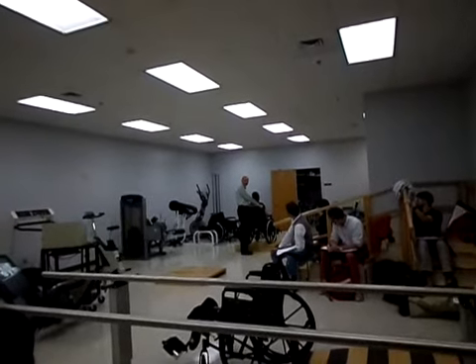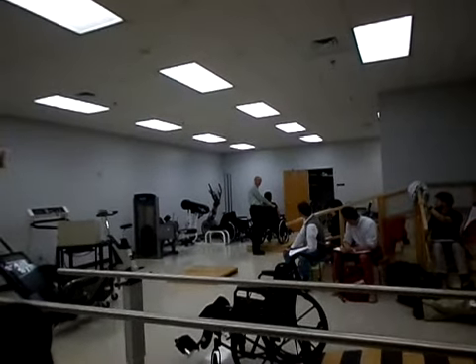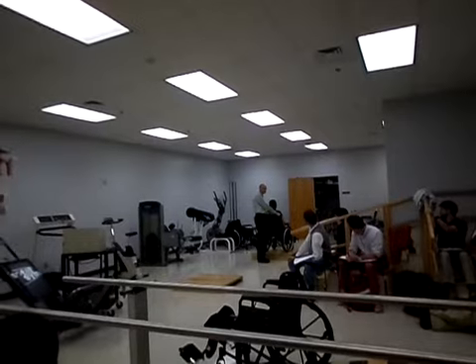Is it easier, do you think, going forward or backward to go down? Backwards. You sure, Jay? I'm not. Okay, but you're right. Going backward is a lot easier. You can't see, but I've got my thigh in here. I'm in really close. I'm going to let her down gently.